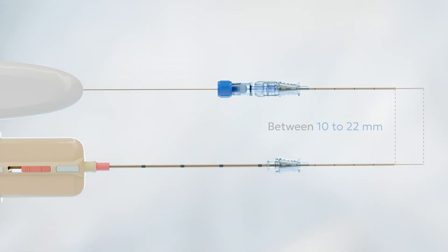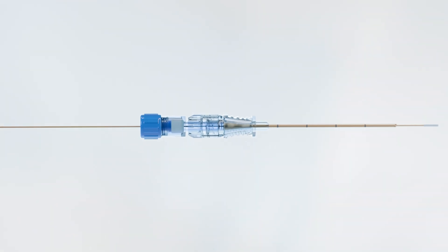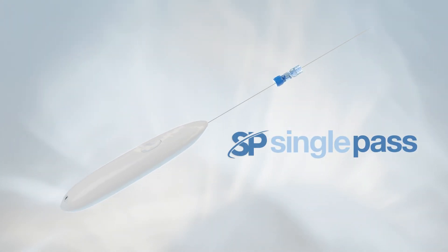The exposed length of the Single Pass probe should now match the biopsy sample length of the biopsy gun. Twist the blue cap on the depth gauge very tightly to secure it to the Single Pass probe. After the depth gauge has been set, remove the guide needle from the probe. The Single Pass device is prepped.